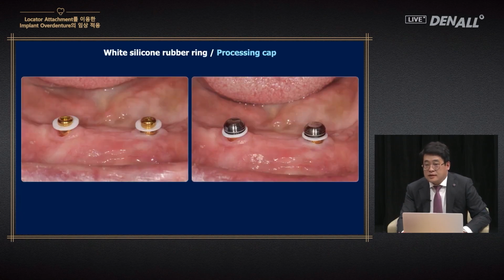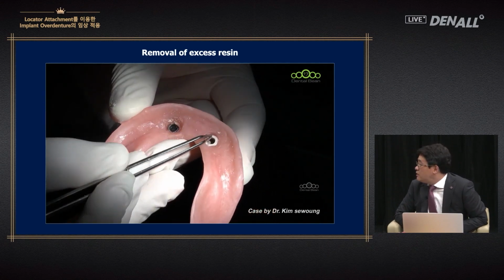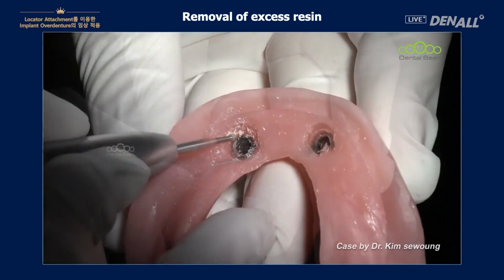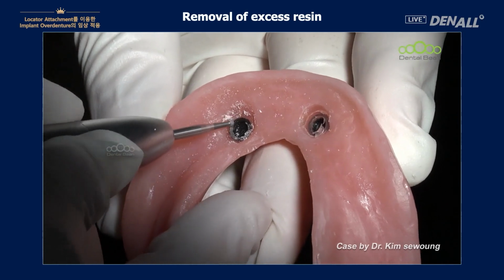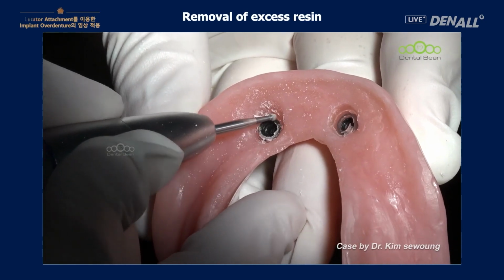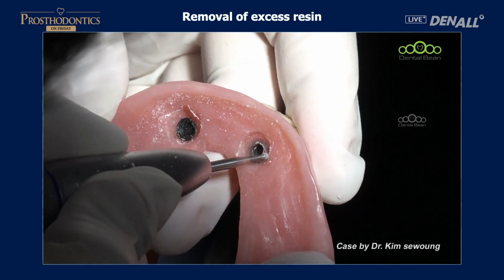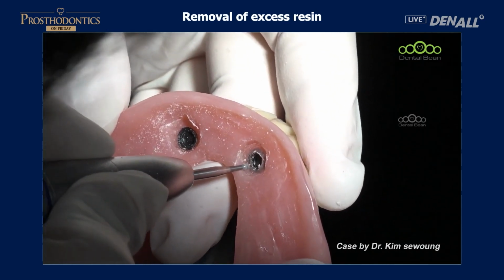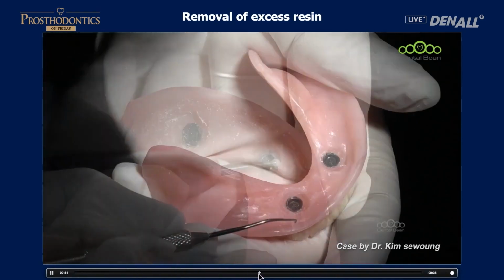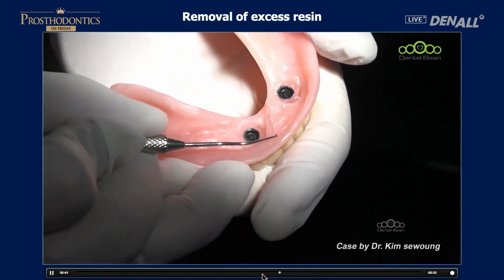Let's look again. This is the same process. We remove. Because the color is the same, you don't really know what is the excessive resin, and you trim the surroundings slightly. Trimming. As you can see, it is removed very easily.